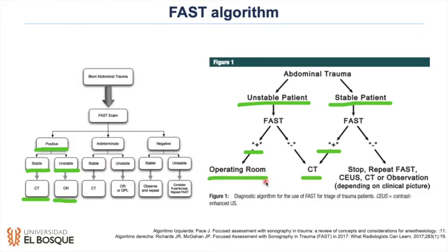But this may overdo some things. So if your patient has, for example, penetrating abdominal trauma, you have to obviously take them right away to an operating room. But if it is a closed trauma and you cannot determine, for example, the location of the injury, maybe you can do a laparoscopic exam first.